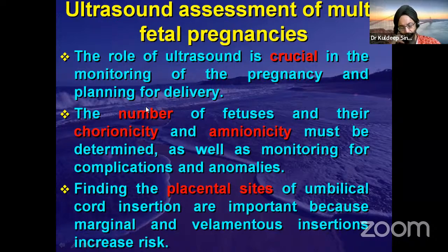More than 8 centimeters is polyhydramnios. Though I normally follow between 3 and 6, I'm a little more conservative in that. Less than 3, I start feeling that there could be a little trouble, and more than 6, again, I just become a little more careful. But the book says between 2 to 8 centimeters deepest vertical pocket is normal.